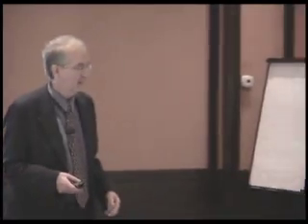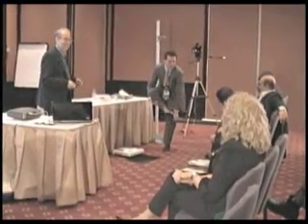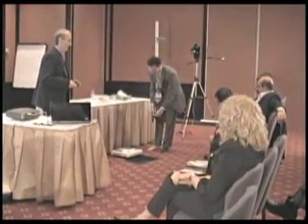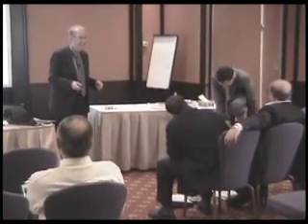Then it can, from there, calculate percentage body fat, percentage body water, etc. So we do that, and there is a chart available that you would get with this clinic that tells you by age and by gender what your normal would be or your ideal would be, and you use that as a target, whichever you choose. So Ryan again, please. Ryan's going to take off his clothes so that he can be accurately measured here. Actually, he's just going to take off his socks. Don't worry. And, you have to be barefoot.